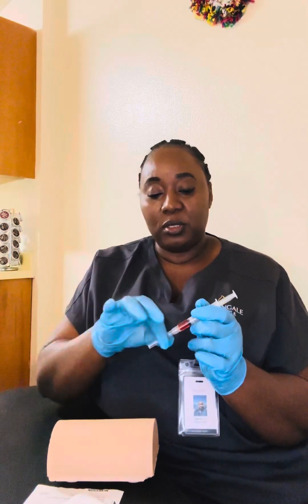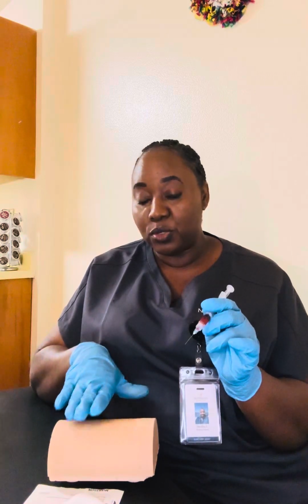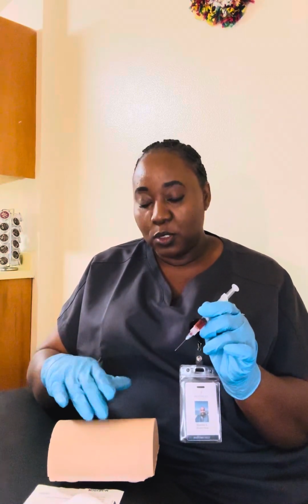Heparin subcutaneous is going to be administered at 45 to 90 degrees. And the way it's going to be done is I'm going to pinch the skin, and because it's heparin, I would like to hold the skin pinched throughout administration. I'll take off the cap. Before administering, I will have checked the skin, palpate the skin, make sure there is no bruise, the skin integrity is intact, there are no bumps or anything around the skin before administering.